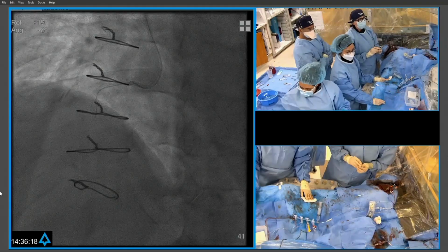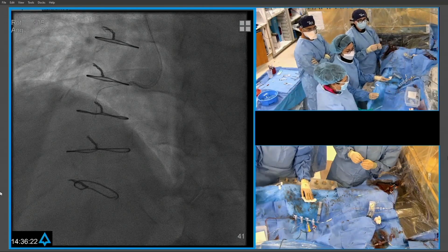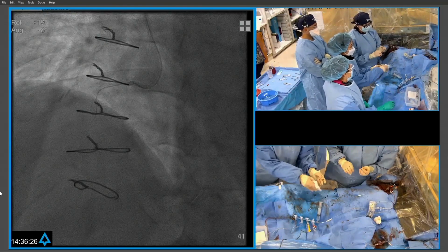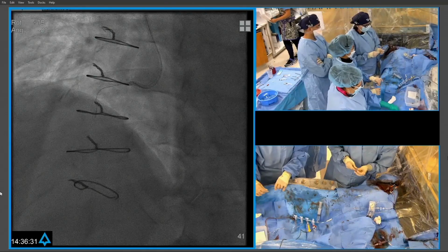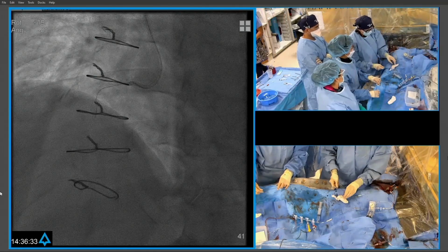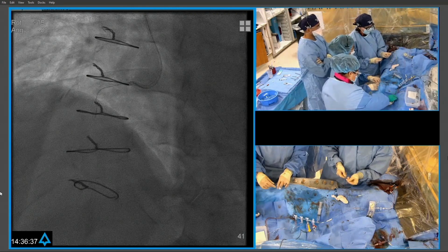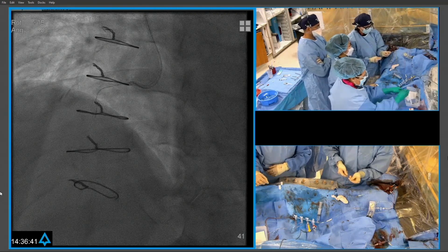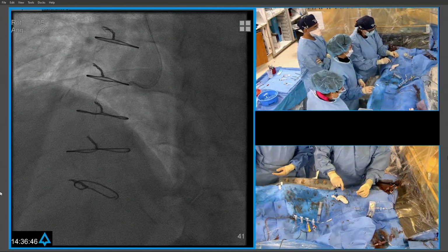This is a Gladius wire, so it's polymer jacketed, so it should stay in the architecture of the vessel with a lower risk of exiting the vessel and causing perforation. And it gives me 3 grams of support, so 3 times what I had with the XTA. Another thing that's nice about it is that it's a great wire for knuckling if I wanted to, but I don't want to do that in this case because of that marginal branch. So if this doesn't cross, I'm going to go with the dual lumen and see if I can redirect, just like we discussed earlier on.